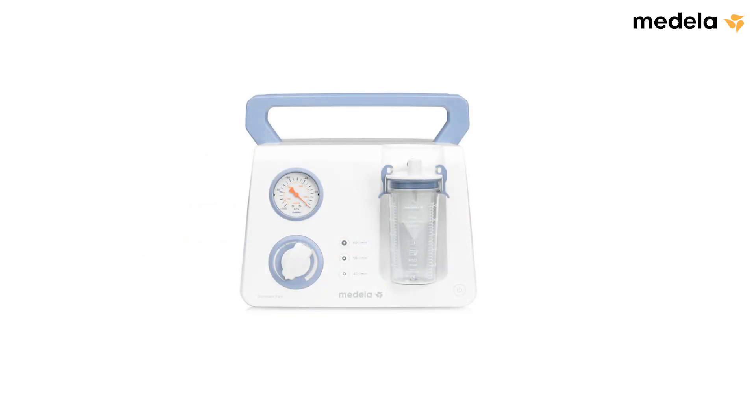The Medela Dominant Flex has separate controls for flow and vacuum. A good way of understanding the difference is to think of flow as speed and vacuum as power.